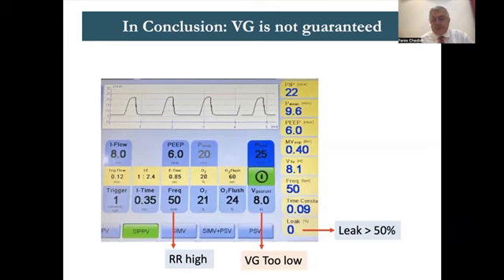Now, what about the inspiratory time? As I showed before, if you don't give enough inspiratory time, then the volume will be lost and the pressure will shoot up.